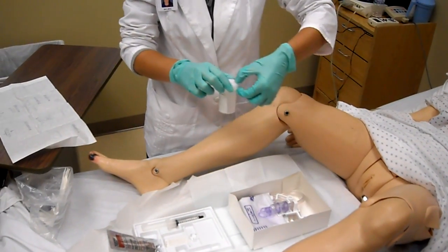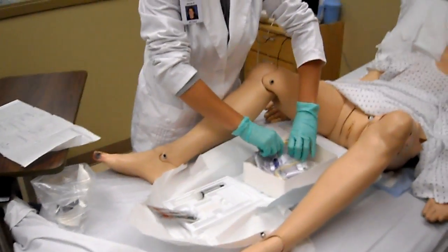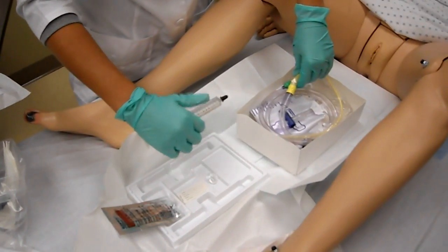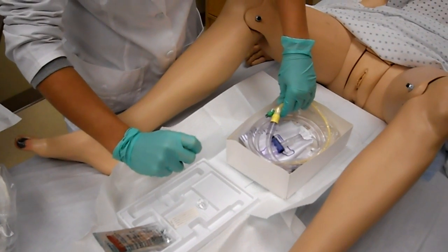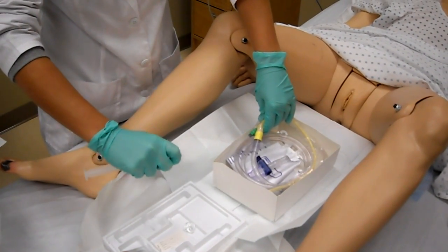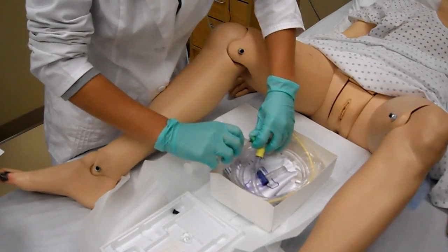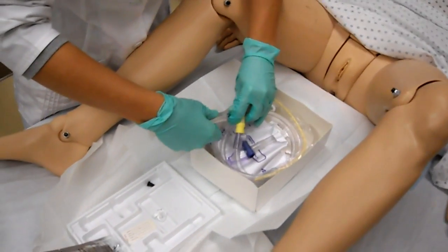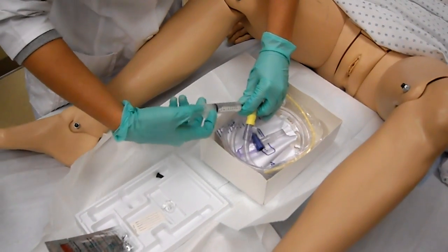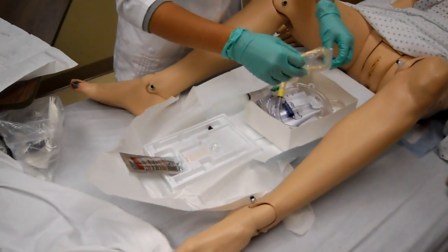Next, you're going to take your specimen cup out. We're going to check the balloon and make sure that there is no moisture, leakage, or breakage. Then you can just leave that attached and take the wrapper off.